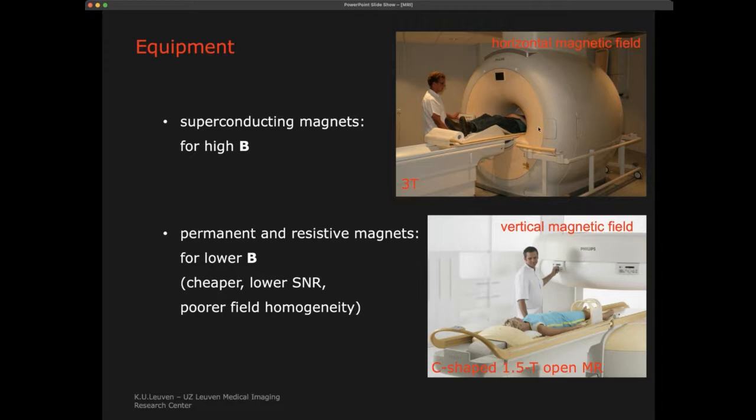But imagine now, if you look at this scanner, there is a copper coil or some other kind of metal. It's actually superconducting material, which is some combination of metals. So you have these coils of superconducting material which are embedded in minus hundreds of degrees. So immediately close to you, for example 10 centimeters away from the patient, you have an extremely cold environment. That, of course, makes it quite challenging to make these things.